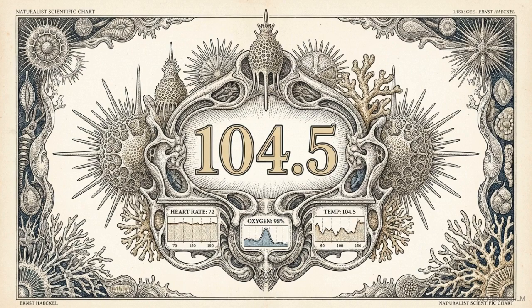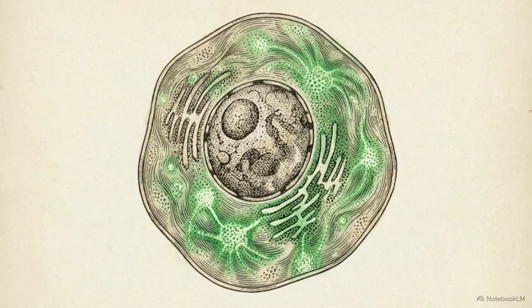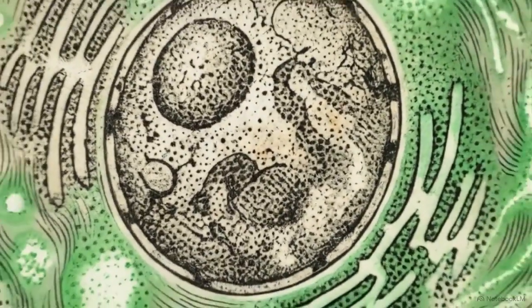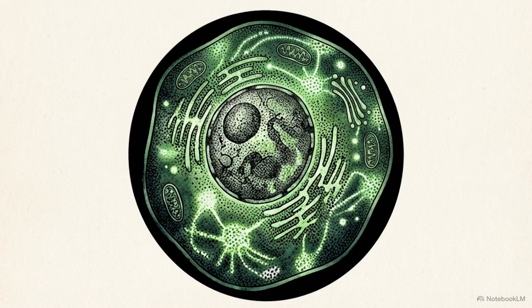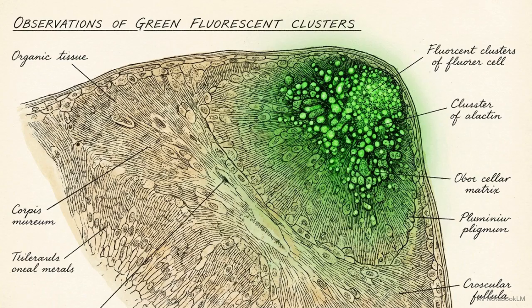Not all diagnostic readouts rely on colorimetry. Immunofluorescence swaps the enzyme for a light-emitting fluorophore. A fluorophore is a chemical compound that re-emits light upon excitation. This allows pathologists to physically see the target. Direct immunofluorescence, or IFD, applies these glowing antibodies directly to a physical tissue biopsy. This localizes specific bacterial or viral antigens right at the site of infection.